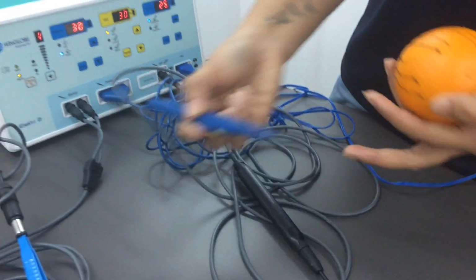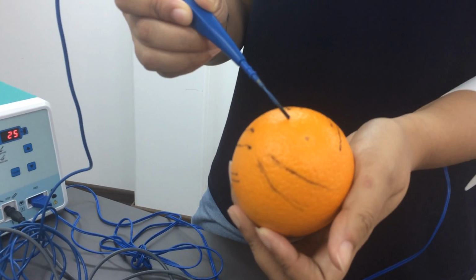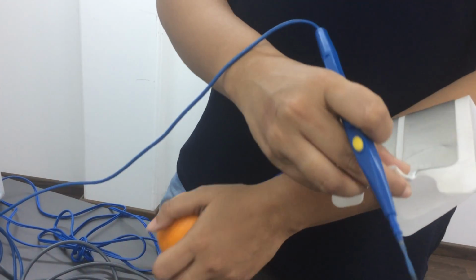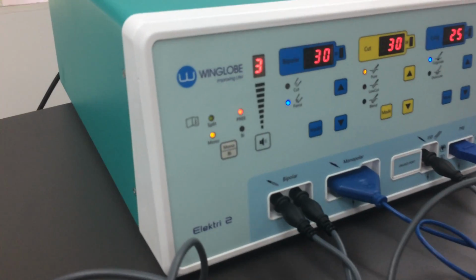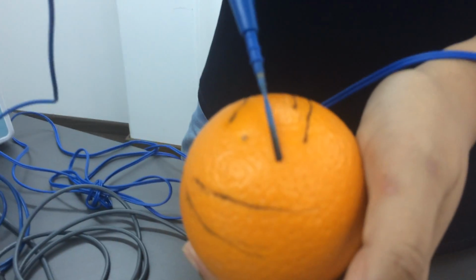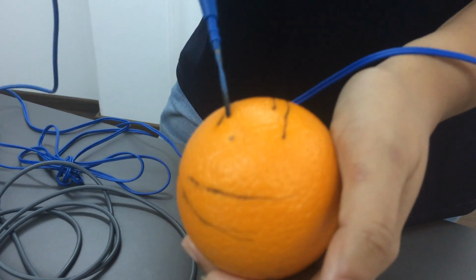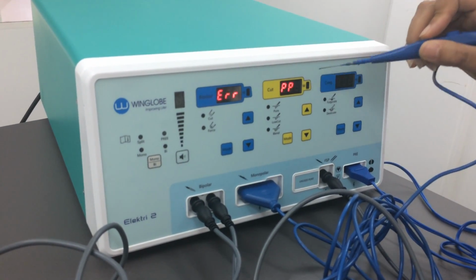One safety feature that we have in the machine is, while the surgeon is operating, if the patient return electrode comes off, immediately the error sign comes and thereby does not allow the surgeon to proceed with the surgery. As you can see, you have an error patient plate message being displayed on the screen.